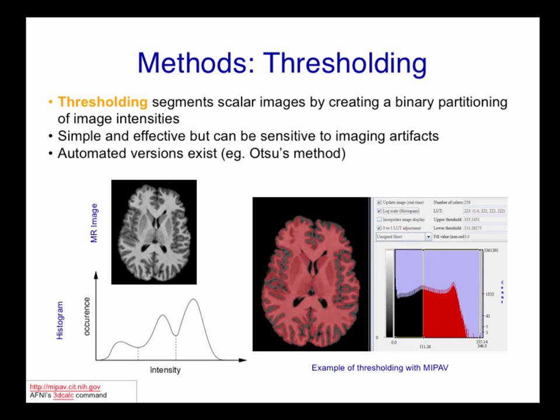So thresholding is pretty easy to perform, as I'm showing here. What you can see is that I'm leaving the grayscale intact for regions that are below the threshold, and turning red the regions that are above the threshold. As I move higher, you see fewer regions in red, and as I move lower, you can see just about everything in red. I also mention down here that you could do thresholding with AFNI's 3dcalc. It would be very easy to just say image is less than some threshold value.